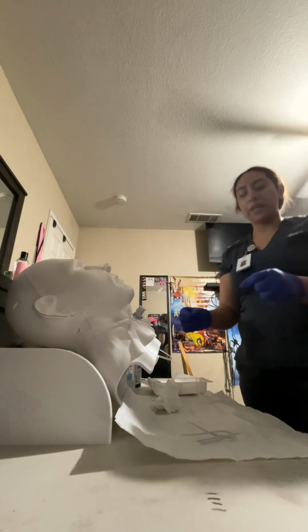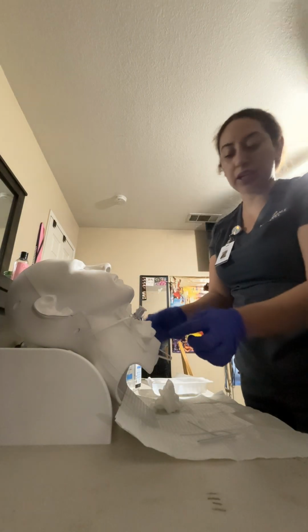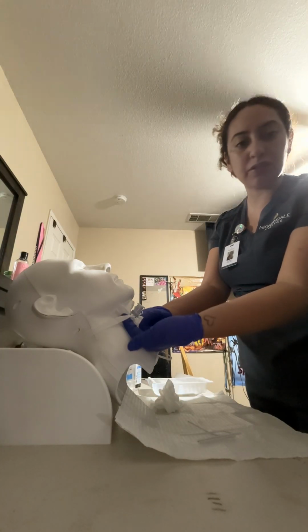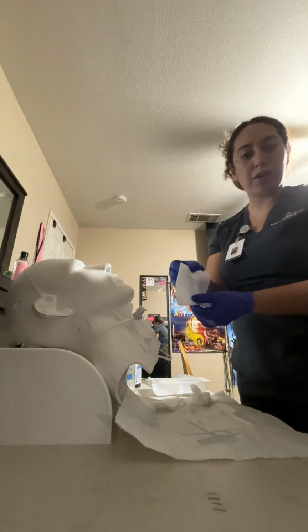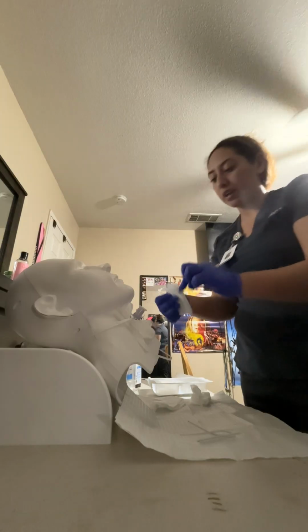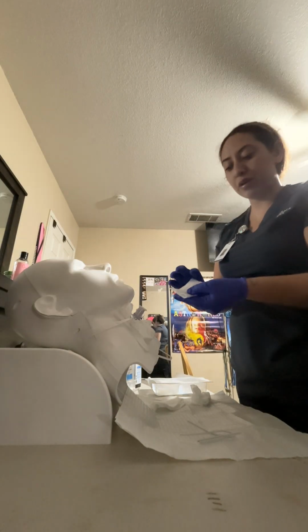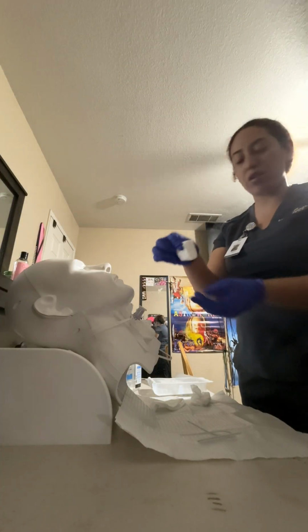Because I had tied knots here, to ensure that the patient doesn't get indentions on his neck because of those knots, I'm going to apply a 4x4. We're going to fold that in half, tuck it and tape it, and we're not going to tape it onto the patient's skin, but we're just going to tape it so the edges of the gauze close over.